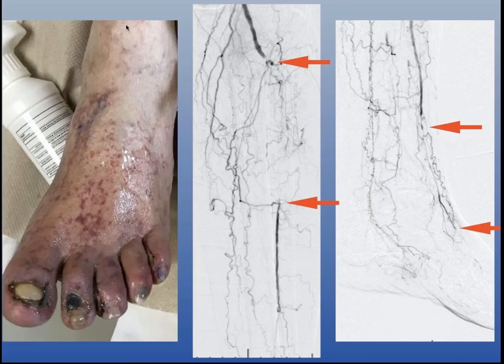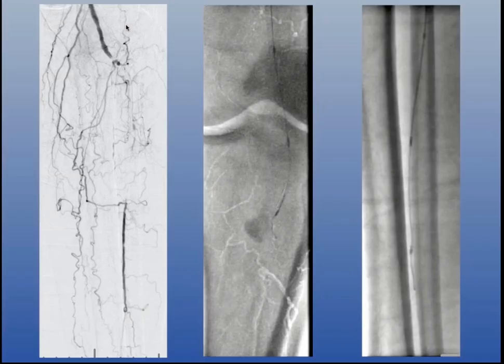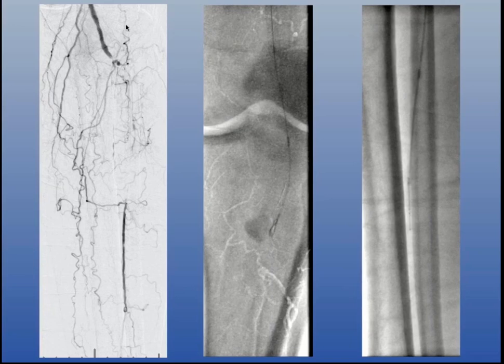So again, here's that patient we saw. Here's this anterior tibial artery, and you can see that after looking at this, I decided that my best chance is let's go after this anterior tibial, because it looks like there's some CTOs, there's some high-grade narrowings, and maybe we got some hibernating vessels in the foot, which we know. So you can see on that middle image, I have a low tip load guide wire, and I'm basically forcing it to form a loop, as you saw, and then I'm pushing the guide wire. That's a nice knuckle wire technique, so I'm doing my recanalization that way.